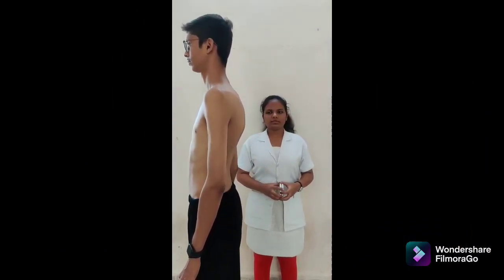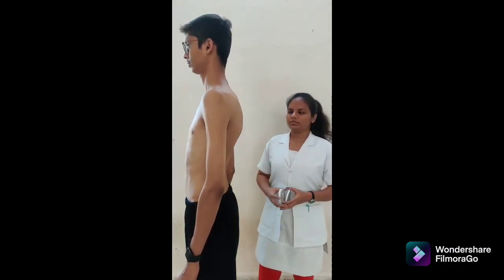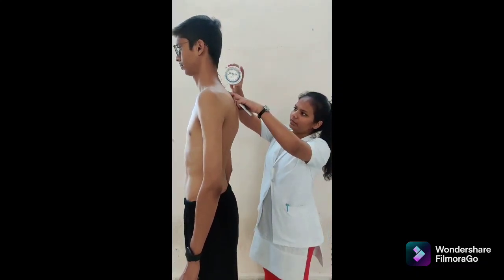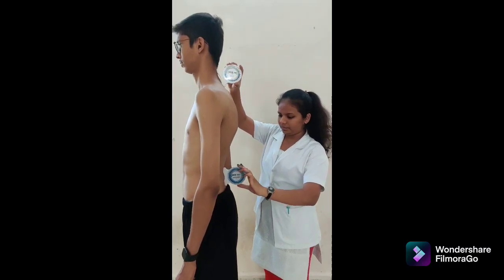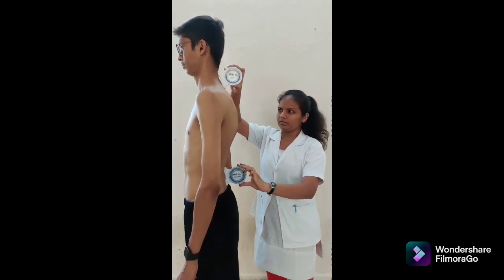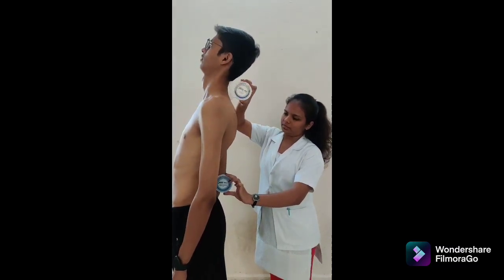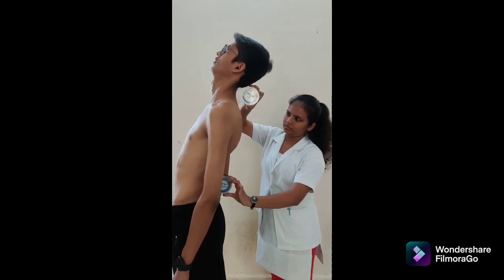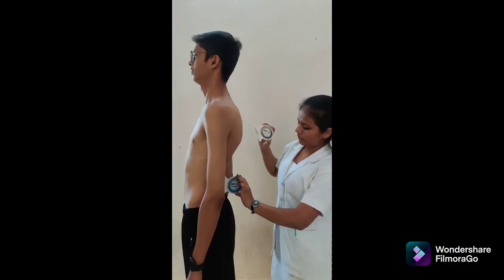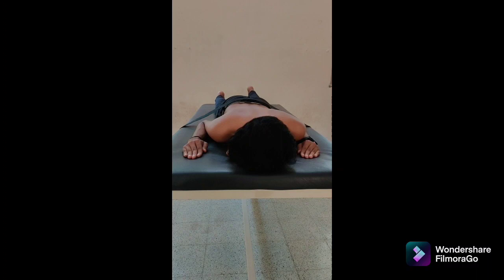Second method for thoracolumbar extension is double inclinometer. Patient position: standing with feet together and knees straight. Inclinometer alignment: place one inclinometer over the spinous process of T1 and the second over S2. Both adjusted to 0 degrees. Instruction: bend backward as far as possible while keeping both arms relaxed and knees straight. Avoid trick movements; no posterior pelvic tilt should occur. At the end of motion, record values on both inclinometers. The difference between the two indicates the amount of thoracolumbar extension. Normal value: 25 degrees.